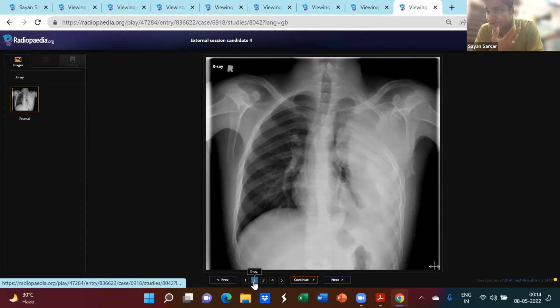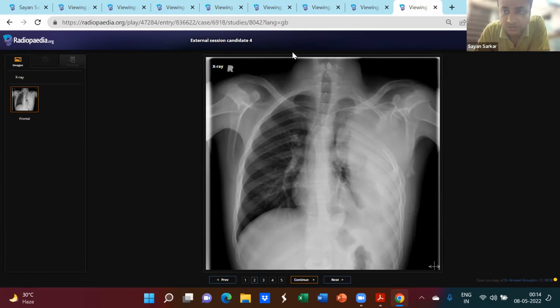So any other things that you want to do when you see this image? Is there anything else that you want to do, I mean, before you comment on the etiology? Anything that you'd like to consider? You mean further imaging? No, I don't mean anything. I'm asking you. I would like to see the exact extent of whatever you have seen.